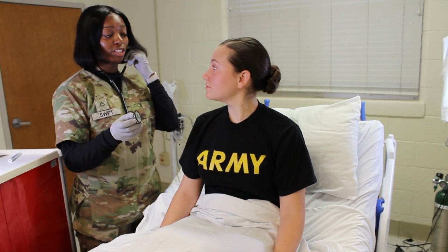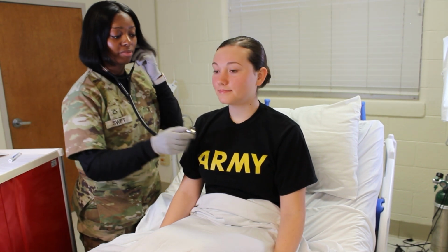Ma'am, you will feel my stethoscope touch your chest. Please just take an inhale for me, okay? Mm-hmm.